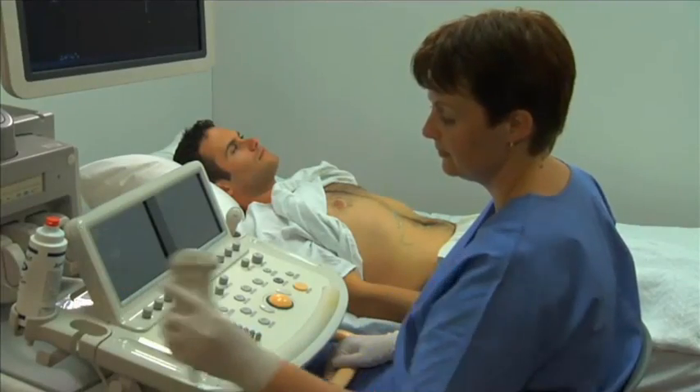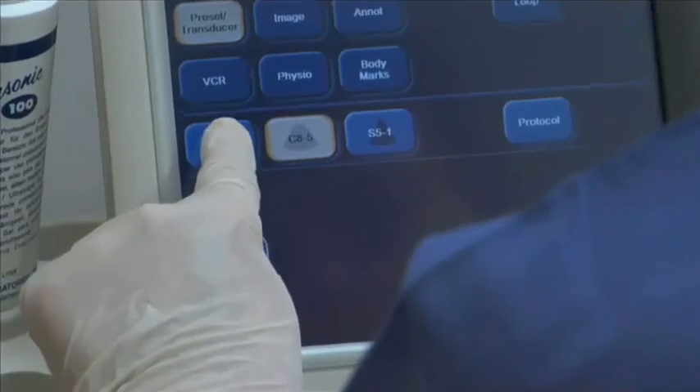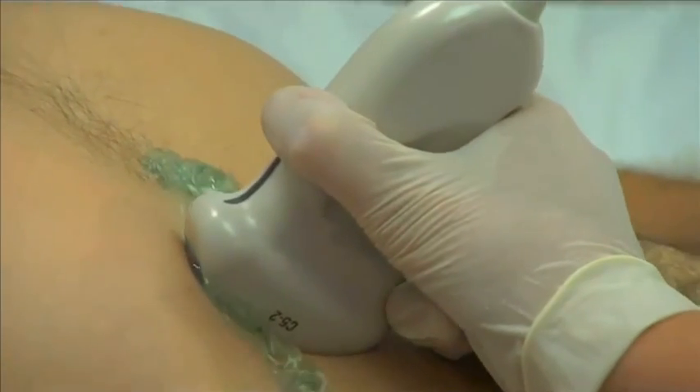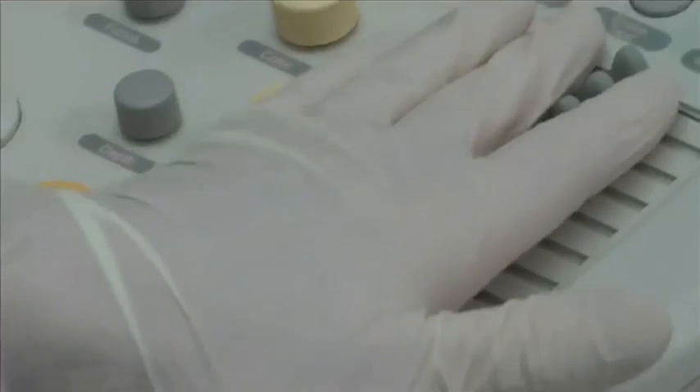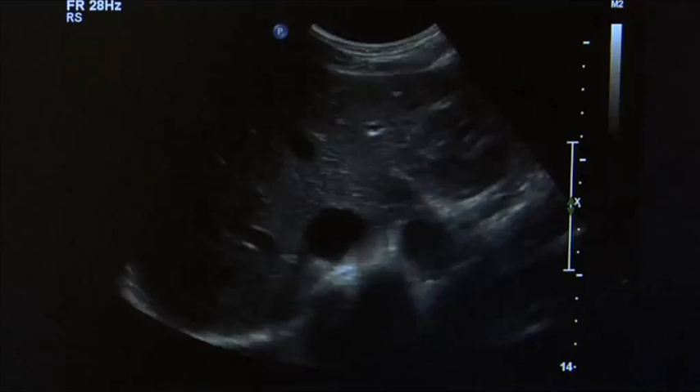Select the appropriate frequency transducer and confirm the correct transducer selection and preset on the ultrasound machine. Perform a survey of the abdomen. Make any necessary adjustments to the machine settings to maximize the image quality.